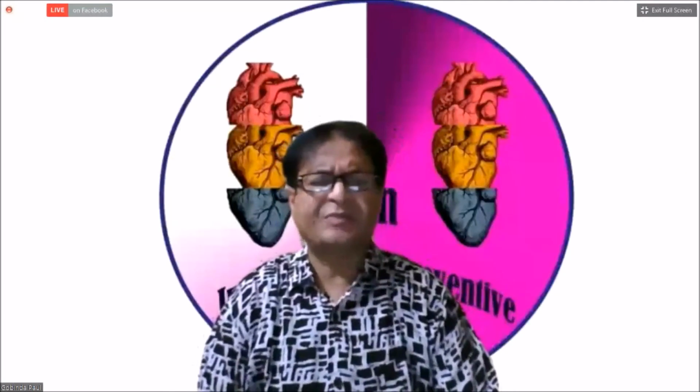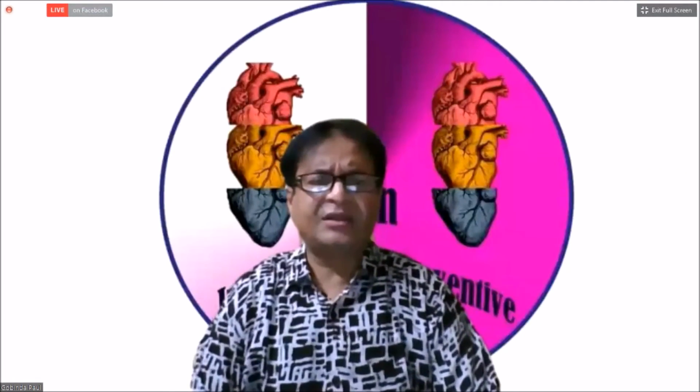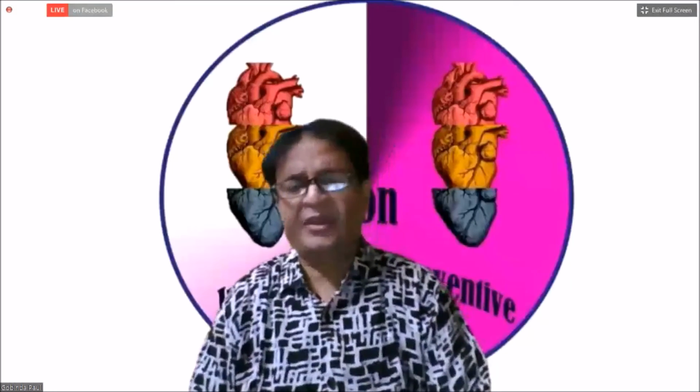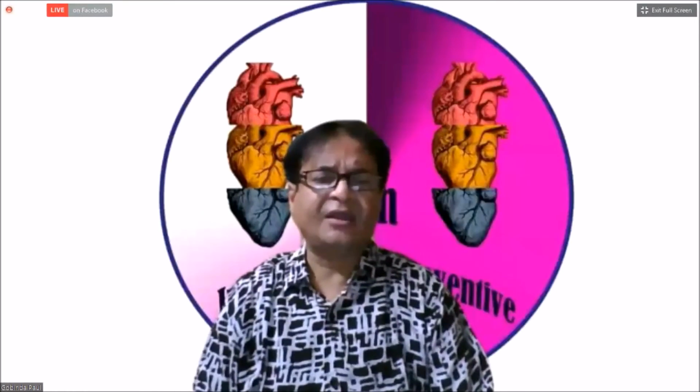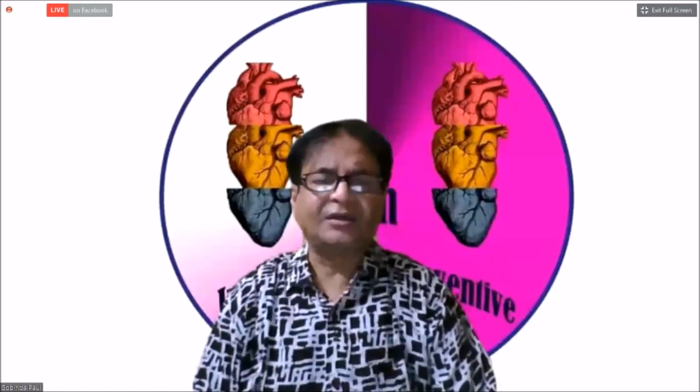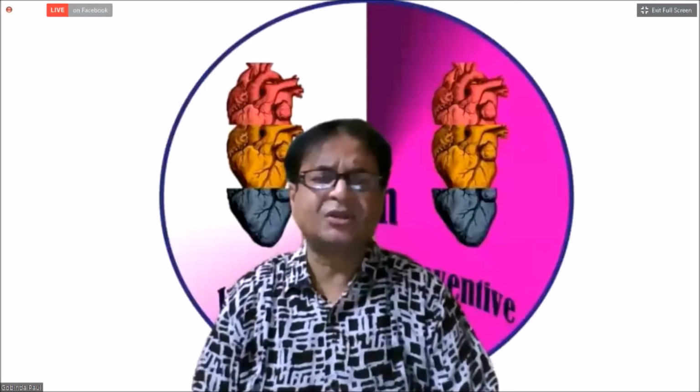What are the DDs of systolic anterior motion of the AMVL? Is it specific for just HOCM or not? So far I know it's not specific, but it can guide. There is a systolic anterior motion of the AMVL in case of HOCM. It can guide us to the presence of some obstruction, LVOT obstruction. But it is not exact.